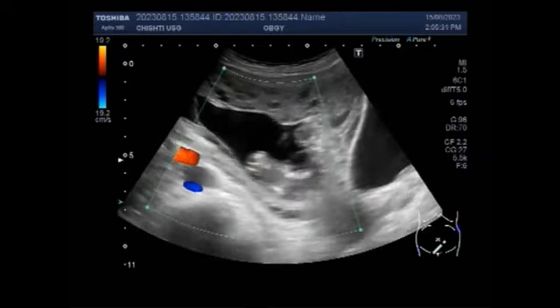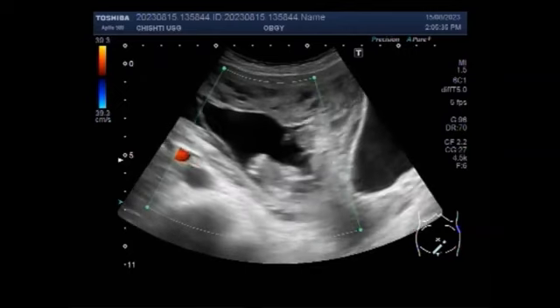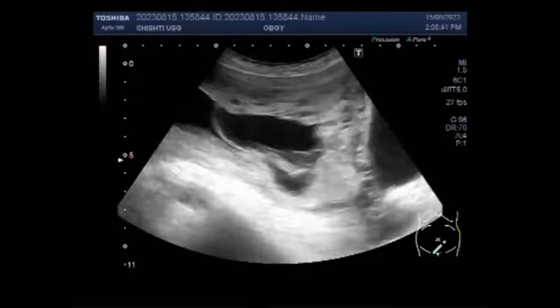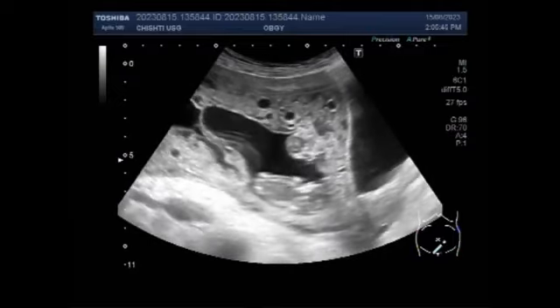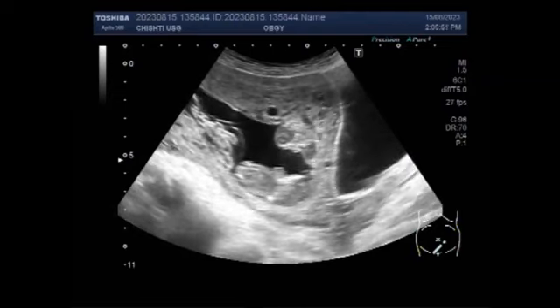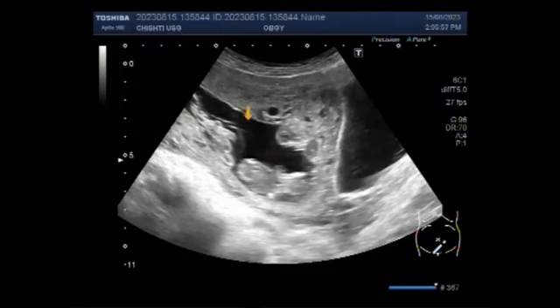Molar pregnancy is caused by cytogenetic anomaly in fertilization and may lead to two clinical forms, a complete and partial hydatidiform mole. The clinical significance of this reproduction is the possibility of evolution to the gestational trophoblastic neoplasia (GTN), which may cause maternal death if not properly treated.